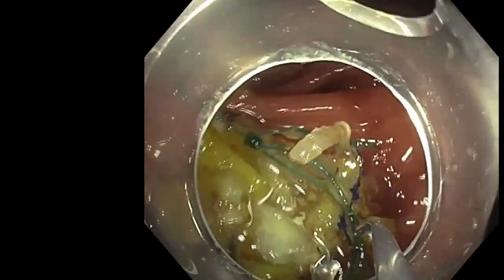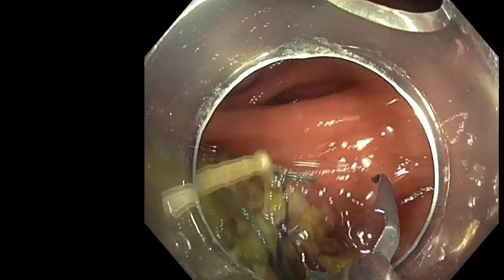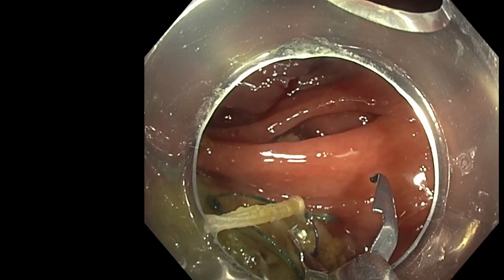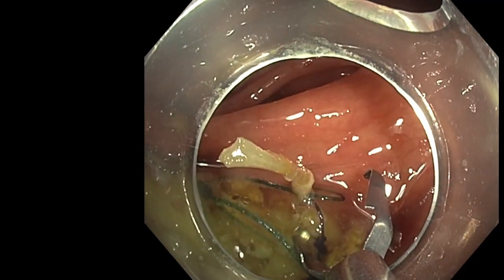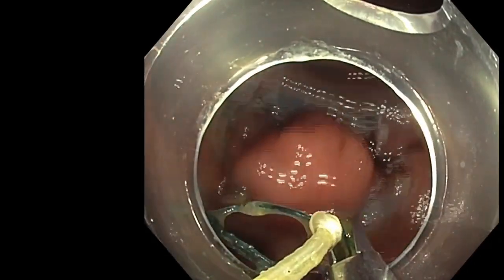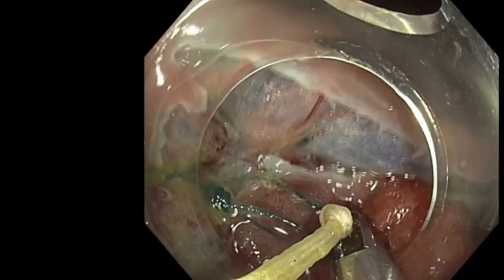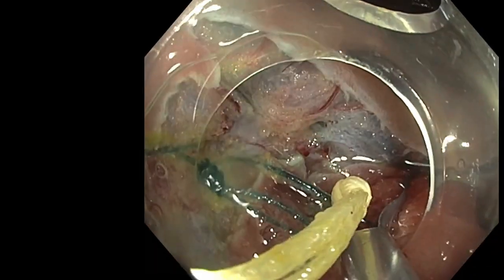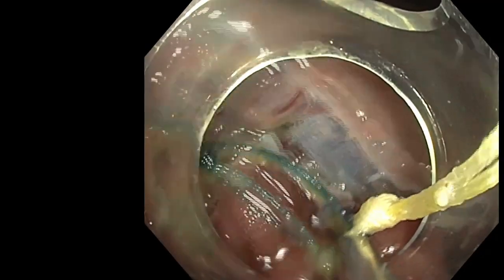So here it was really in the stool, so not easy to catch. One trick is to pull back the device and move outside the stool and the residue. After we catch the fixed point, the goal is to fix it on the oral edge of the lesion without catching, if possible, the muscle.